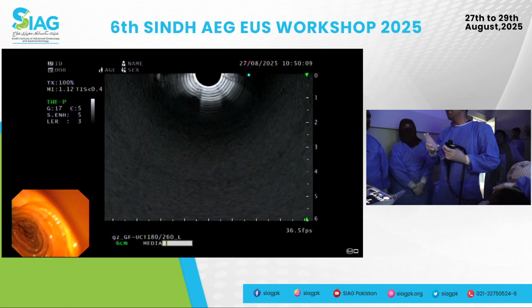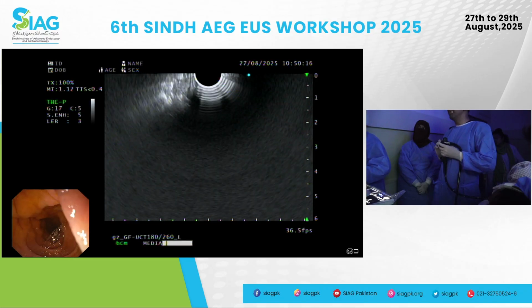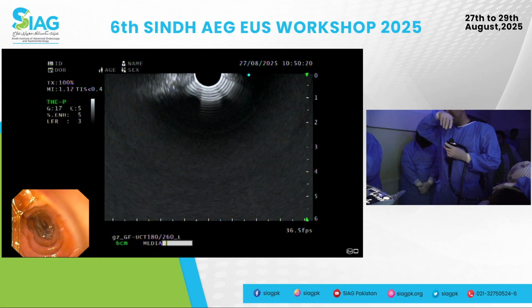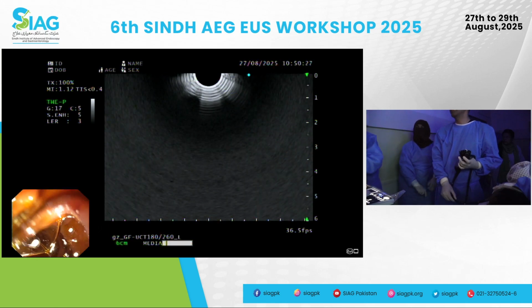I think it's working, obviously, because you've got too much air in, so that's fine. I think it happens. Every time we're trying to intubate, we end up putting more air in, and that's what can cause problems. But that's fine. Should be okay. We're using CO2, aren't we? Akram bhai, are we?